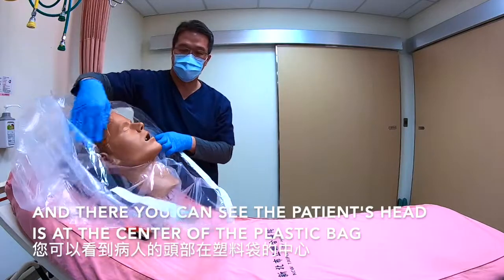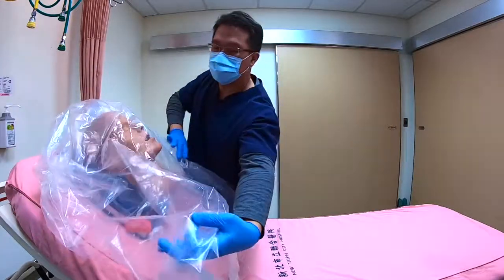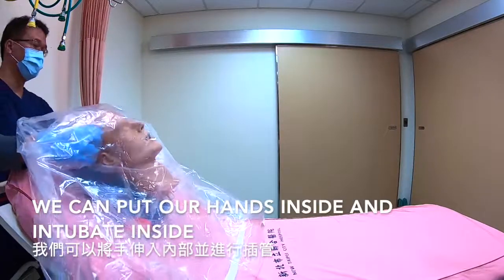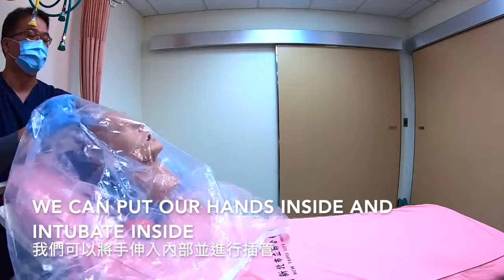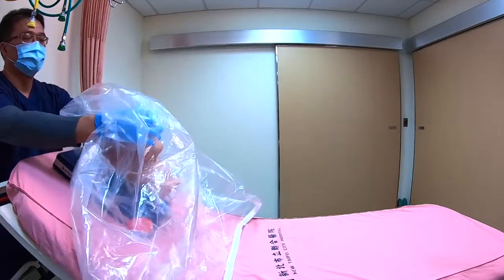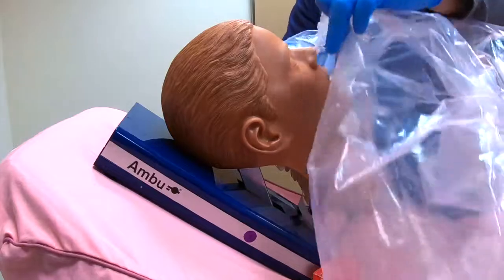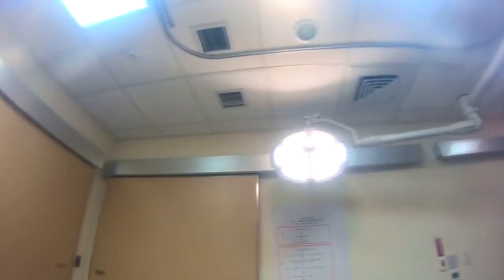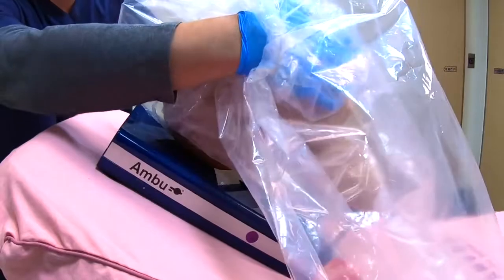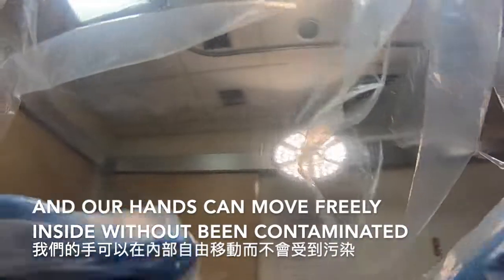As we can see, the patient's head is at the center of the plastic bag. We can put our hands inside and intubate inside. Our hands can move freely inside without being contaminated.